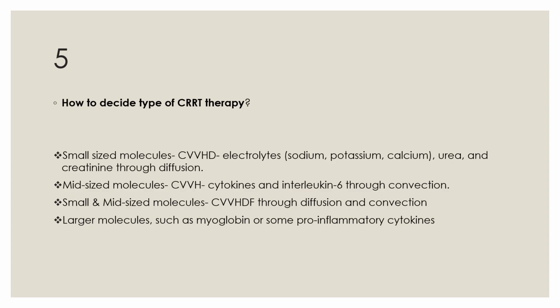Larger molecules such as myoglobin or some pro-inflammatory cytokines can also be removed particularly through hemofiltration and hemodiafiltration, with the specific removal being dependent on the membrane pore size and flow rates. While removal of myoglobin is not a highly efficient removal process, studies have shown that myoglobin can be cleared, particularly with high flux filters and high ultrafiltration volume.